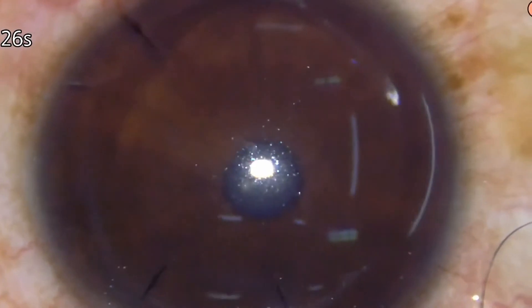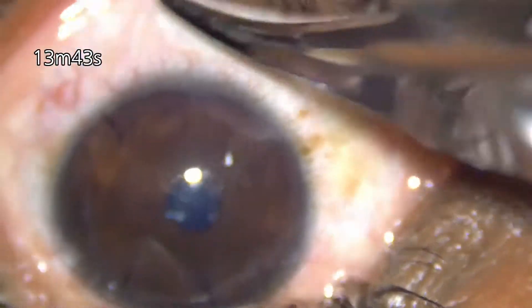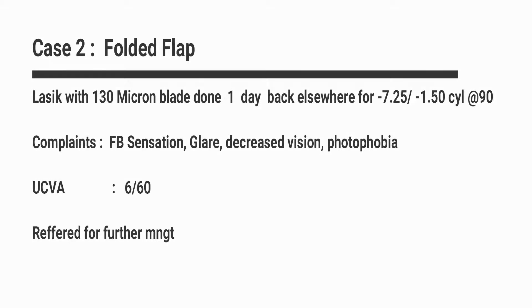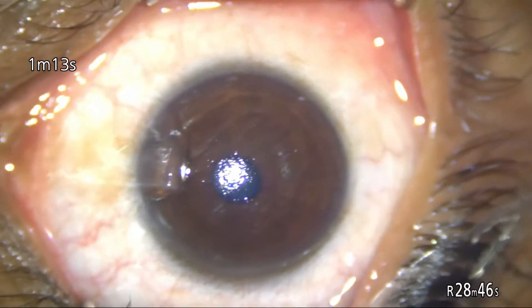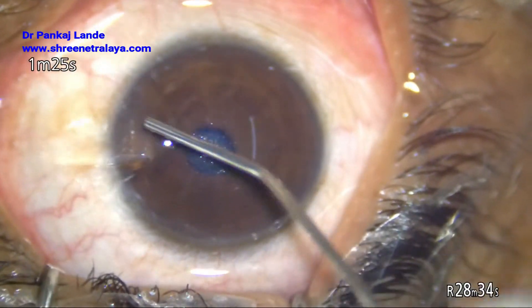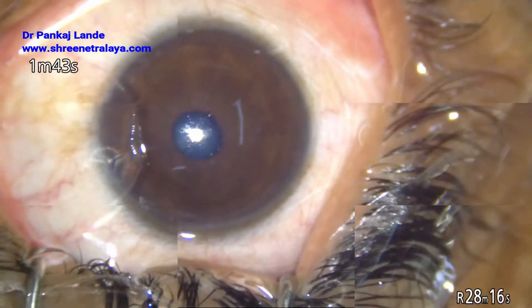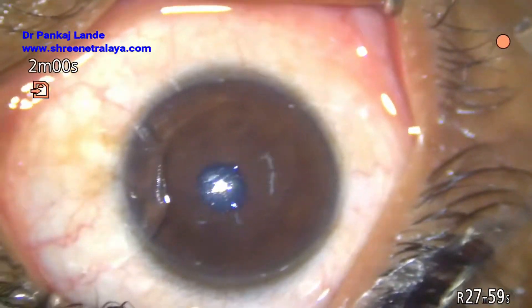In the second case, we have a folded flap. The LASIK was done 24 hours prior with a Moria microkeratome and a 130 micron blade was used. On post-op day one, the patient complained of foreign body sensation, glare, decreased vision, and photophobia. Notice the flap edema. His uncorrected vision was dramatically low. When I saw this patient on the slit lamp, I noticed a folded flap on itself, and an area of epithelial healing was seen on the bare stroma.